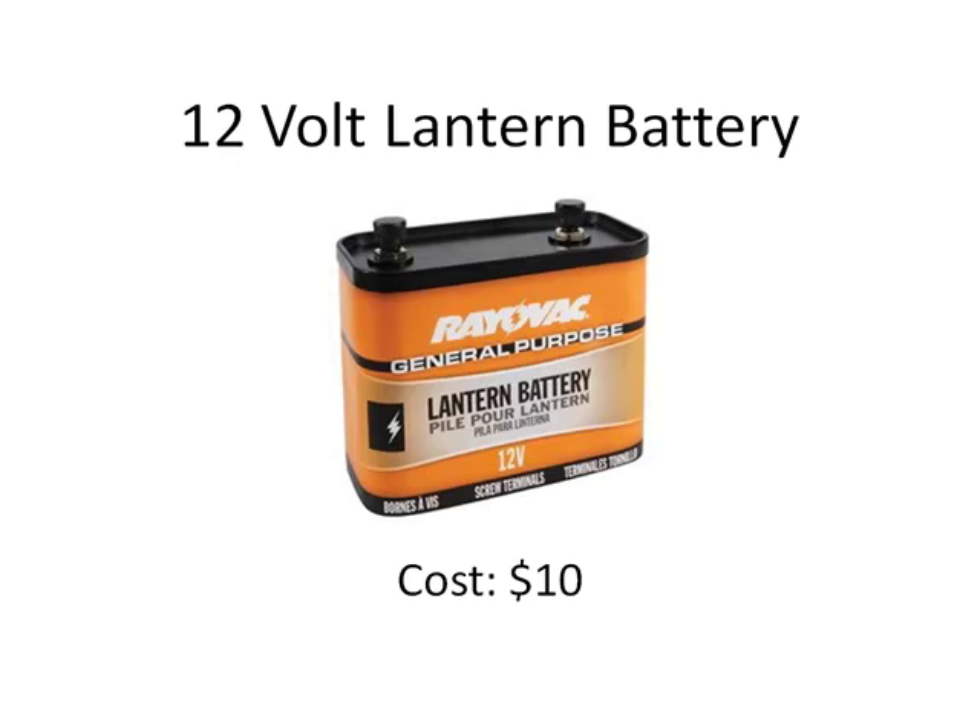First up, you're going to need a 12-volt lantern battery. This is the power source for your iontophoresis device, and it's going to supply the low-level electrical current to your hands or feet. I use the Rayovac lantern battery shown here — it's a good name brand that's durable and has a low price. You can get one for about $10 or less from Walmart, Amazon, or most hardware stores.